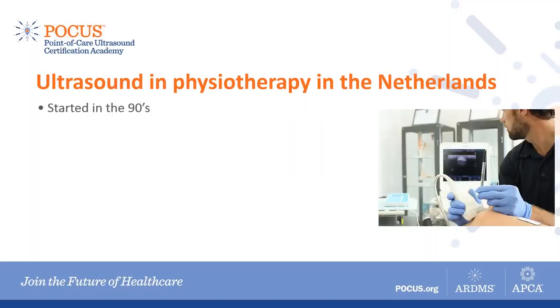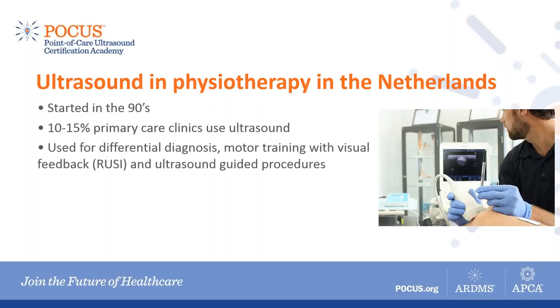Thank you. So what's the situation in the Netherlands with MSK ultrasound? Well, the first physio started with this back in the 90s, but the more widespread applications started at around 2010. There are no official numbers on the amount of physiotherapy clinics using ultrasound, but we estimate this number to be around 10 to 15%. Physios use ultrasound to help in the differential diagnosis, obviously, but it's also used to train specific deep muscles using visual feedback for the patients as an alternative to EMG.